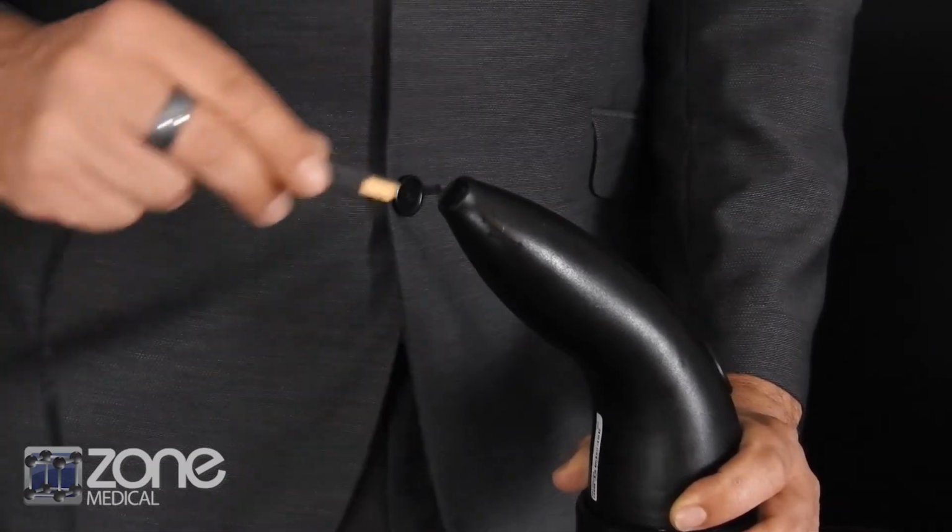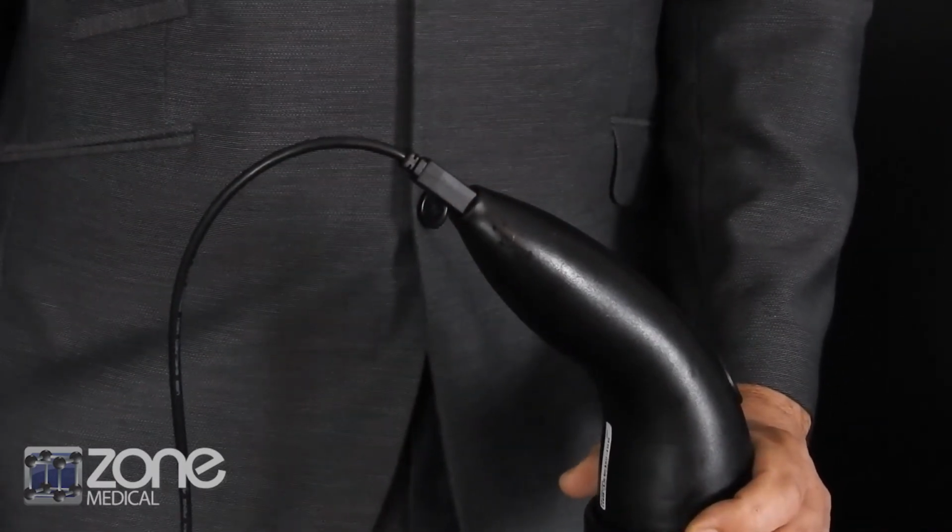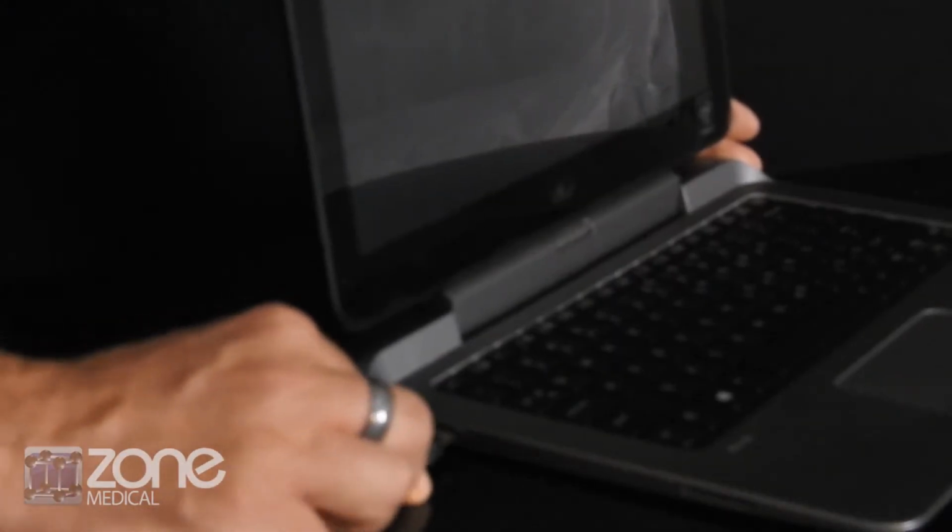Once you've installed the software on your PC, to begin operation of the device, simply plug in the USB cable connection to the unit and your USB socket into the computer.